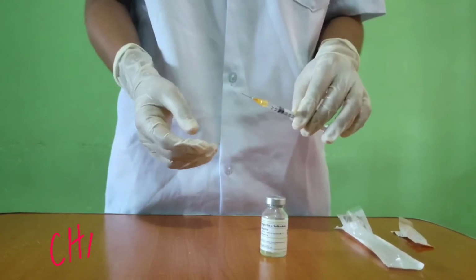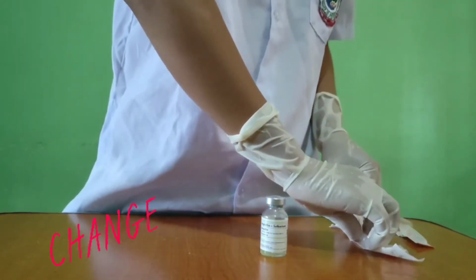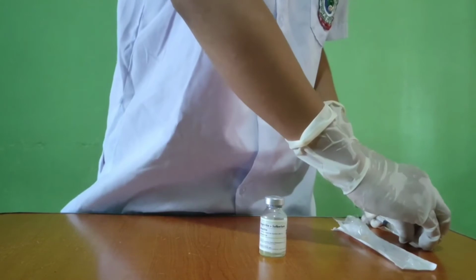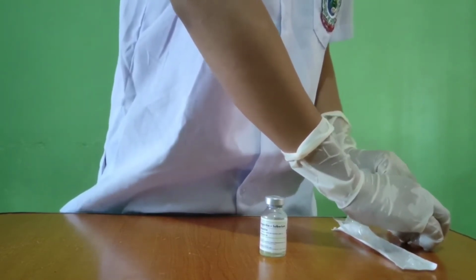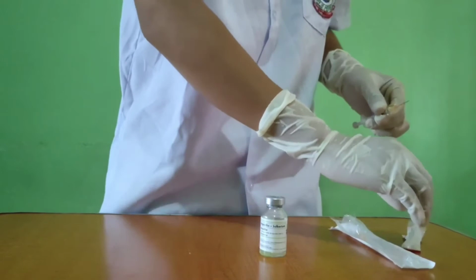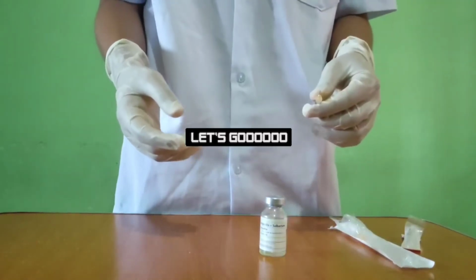We're going to change the needle of the syringe. It is important to change the needle. The reason why we change it is that it's already dull and we don't want to insert it into the patient. Now we're ready to inject the patient.